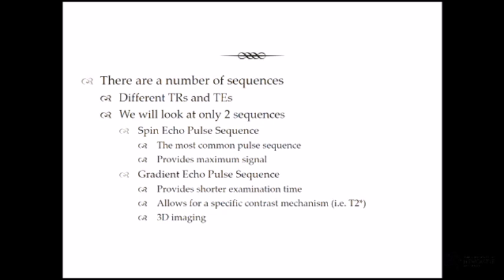We can also do gradient echo pulse sequences. Typically these run for shorter. I showed you on that tree where we were doing some breath hold imaging. On Siemens scanners, we use a VIBE sequence. Obviously we want those to be much shorter. If we think of our spin echo imaging maybe going for 3 minutes, no one's going to hold their breath for that long.